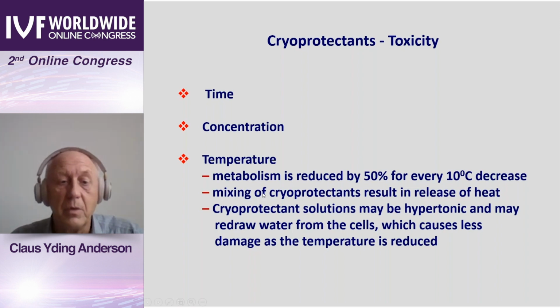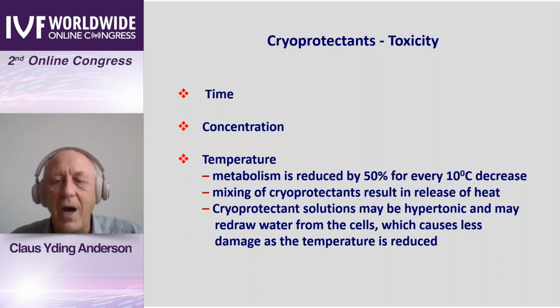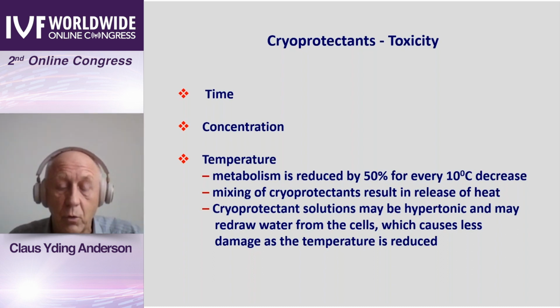What we also have to understand is that if we mix the cryoprotectants and keep the cells in contact while we mix the cryoprotectants, it actually may release heat, just mixing the cryoprotectant. So we need to make all these solutions beforehand, which is what we normally do.